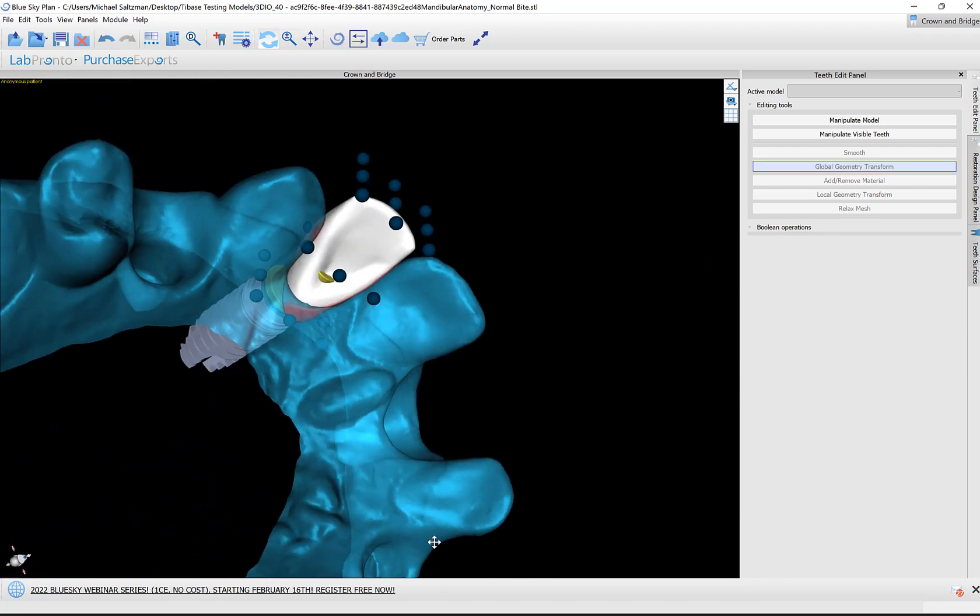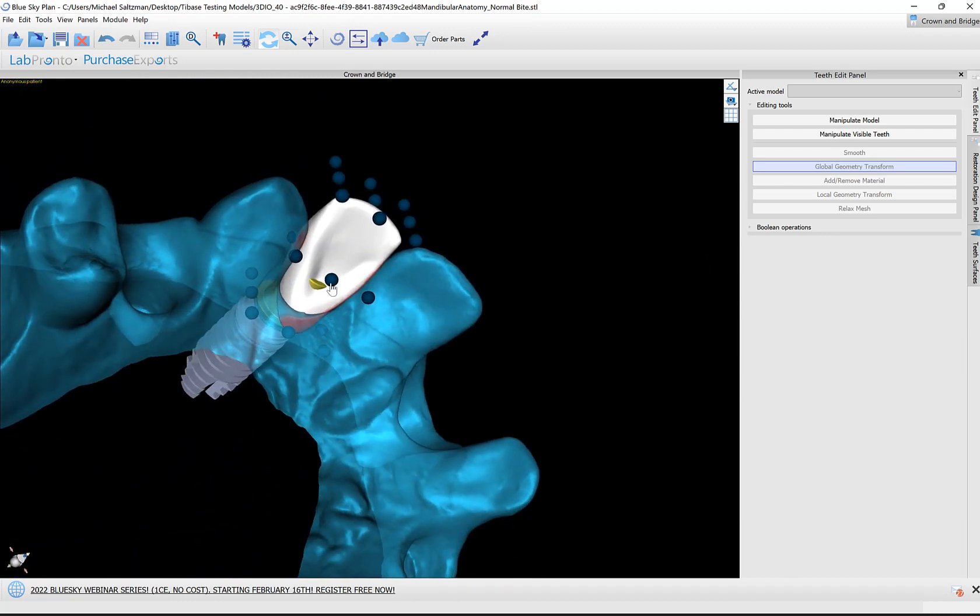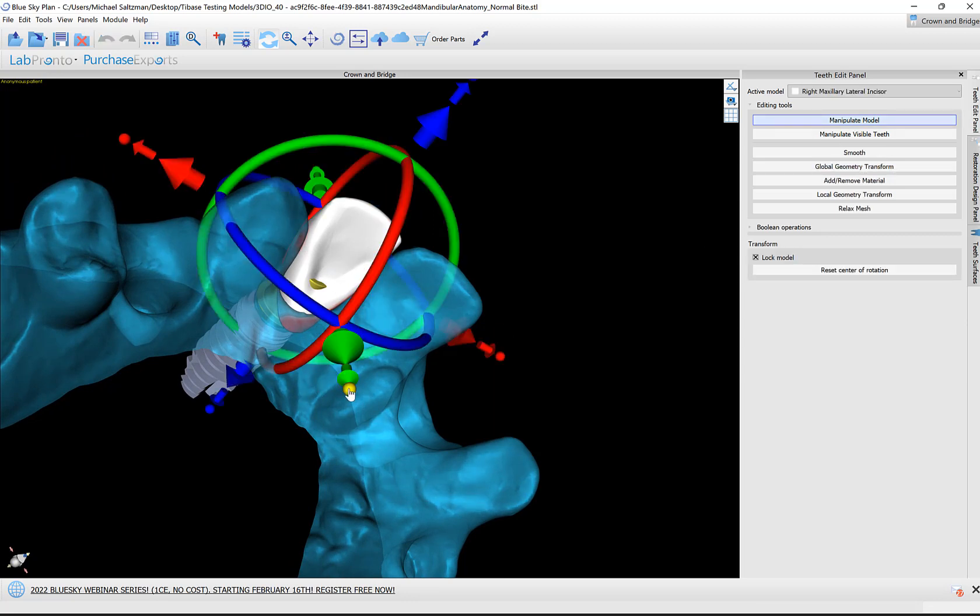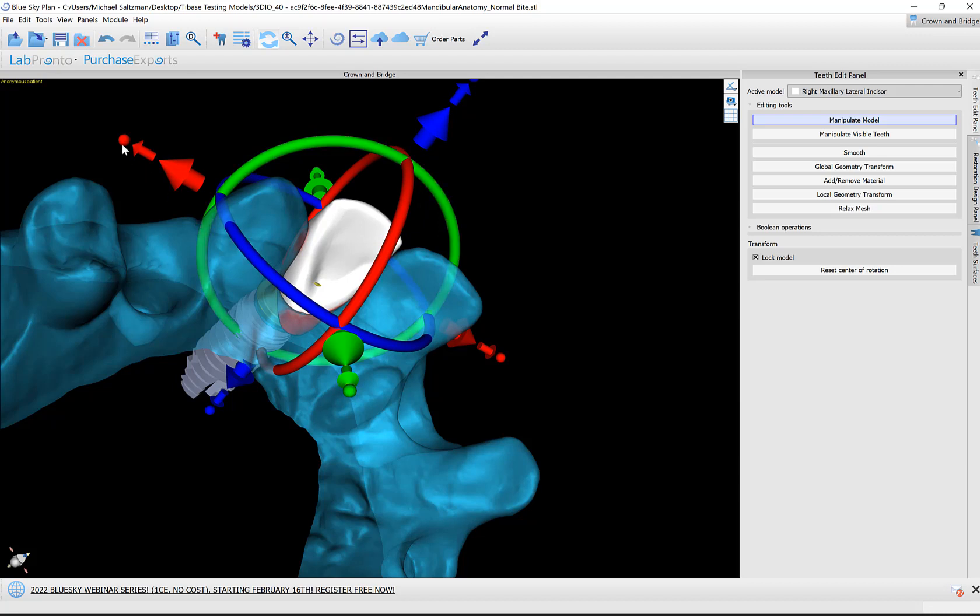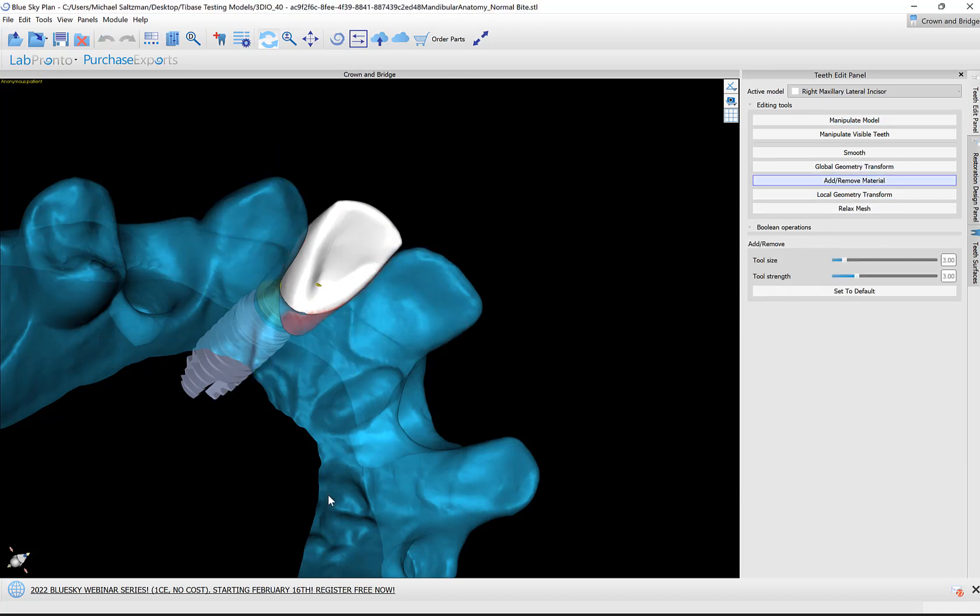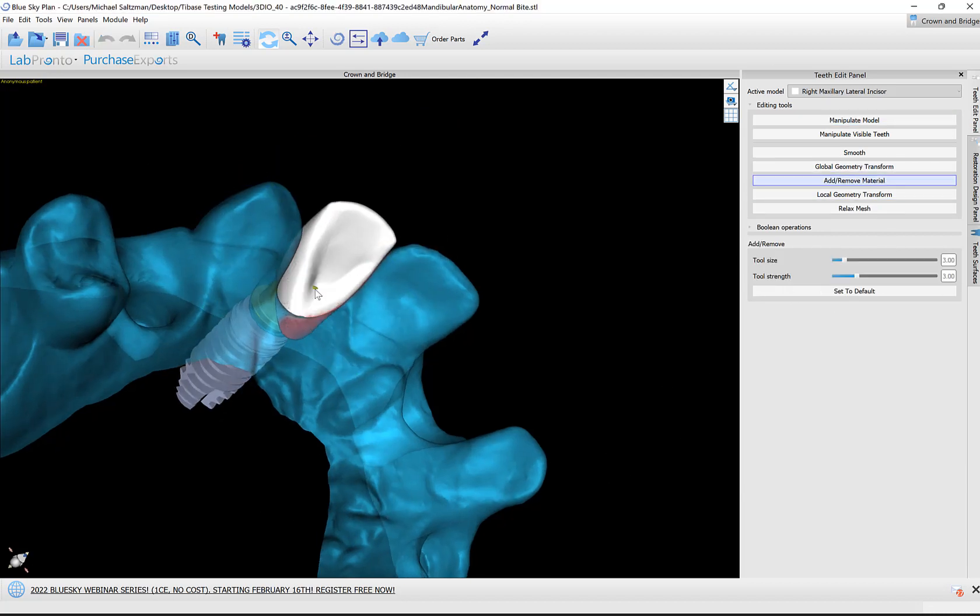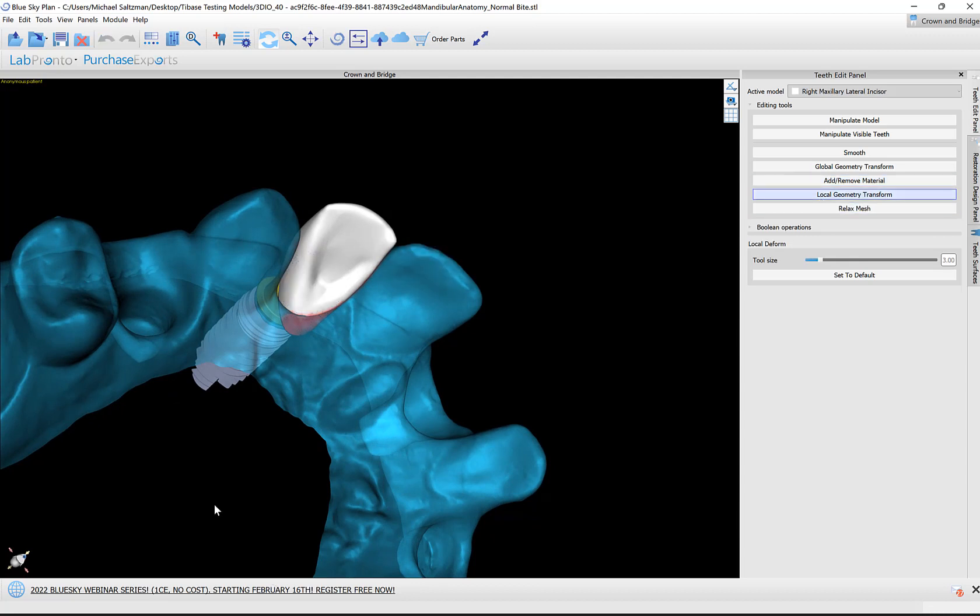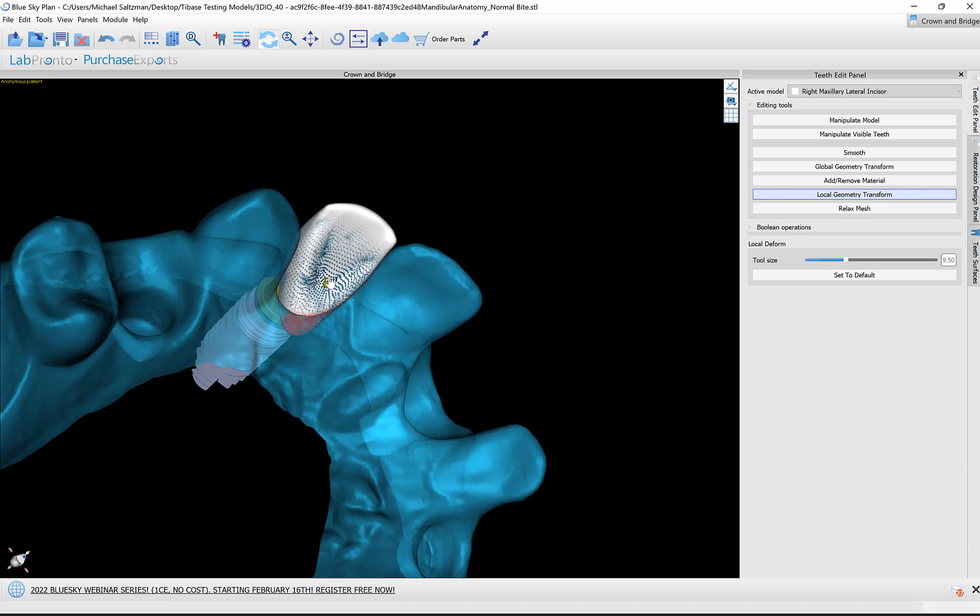We could really spend time designing a beautiful tooth here if we want to make those modifications. We do want to deal with any situations where we see the titanium base protruding. We also want to make sure there's sufficient material so when we create the crown, we have minimal thickness. Let's add some material over here. Left mouse button while holding down shift, we're just clicking and adding some material. We could also use local geometry transform, which I like. Let's make the tool a little bit bigger and just grab part of the tooth and drag it in the direction that you like.